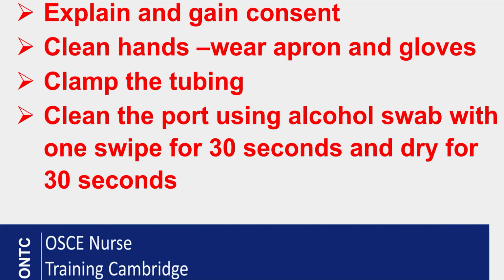Like any station, you need to make sure you do the scene safety, draw the curtain, clean your hands, fully explain the procedure to the patient, and gain consent. If the ID check has already been done, you can skip that and just say the ID check has already been done as per my briefing. Take the informed consent, then make sure you have all your equipment and have checked the dates of expiry on all your consumables.